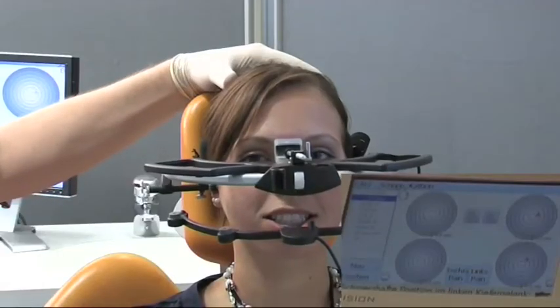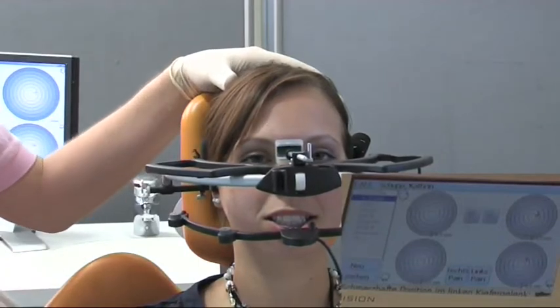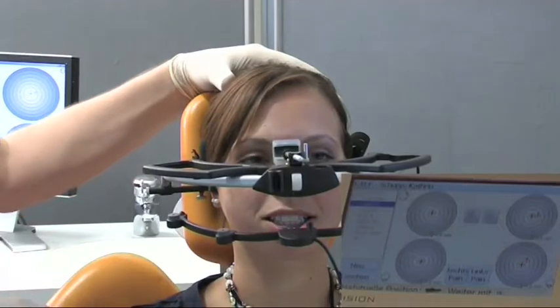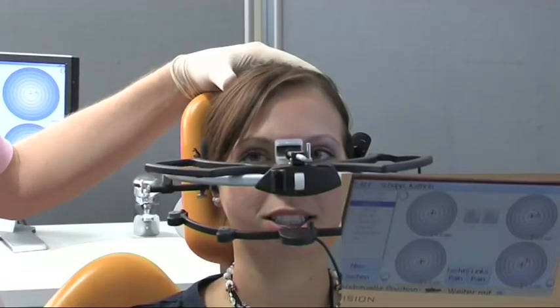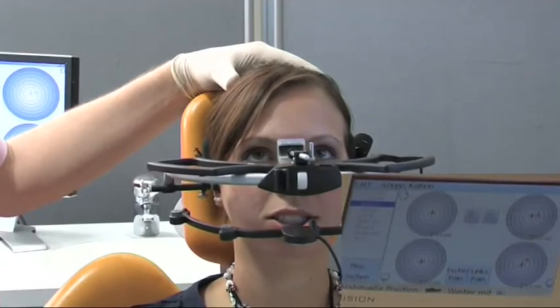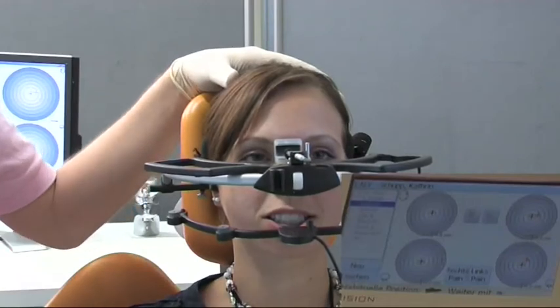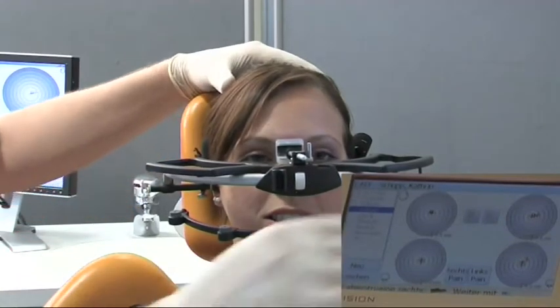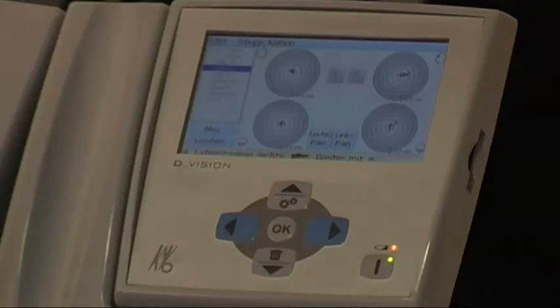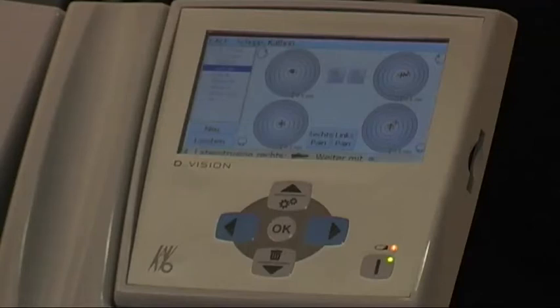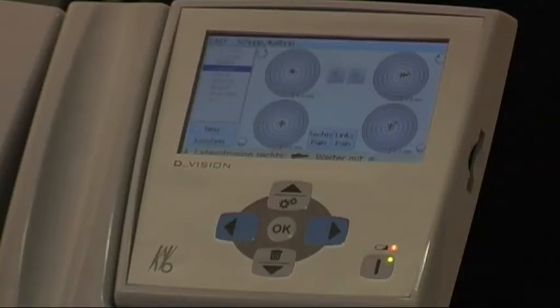We can do the same for the other side, but we don't need to do that — we can skip that here because there was nothing. Now bite down as you would normally do, just as your bite is. Hold it there. You can see here — that is the last black cross. Your condyle is there when you have pain. There is your condyle when you use your teeth. Therefore, your static occlusion does not lead there. That means your bite, even if it is not ideal, is certainly not responsible for your pain.